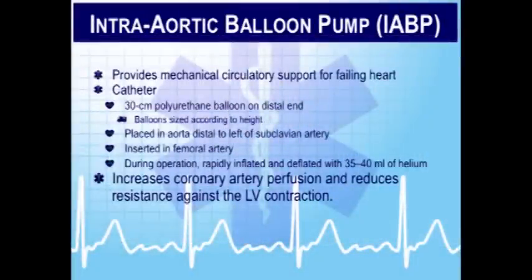So the intra-aortic balloon pump. How many of you have seen a patient on a balloon pump ever? It was initially designed for short-term management of patients that are having an acute cardiac event. Okay, it's broadened its scope a little bit, but it still is basically used for short-term management of somebody undergoing some sort of acute cardiac event.